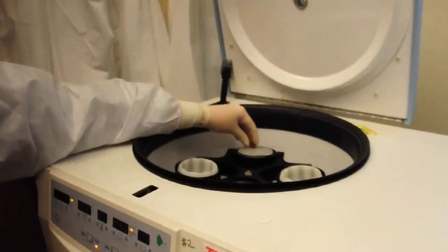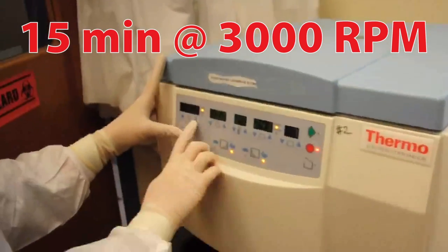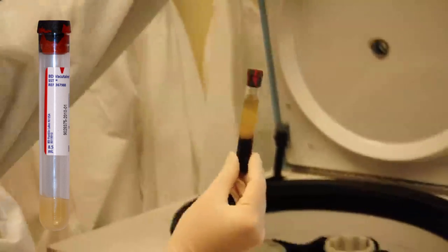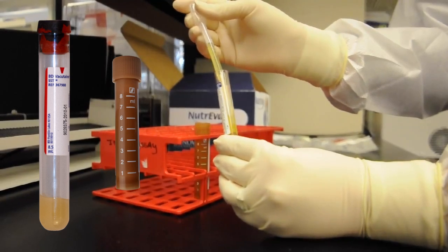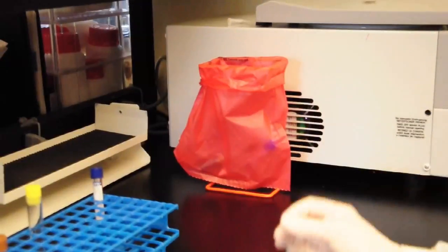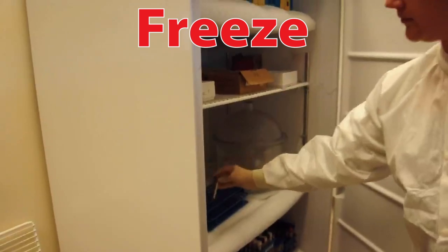Centrifuge the red Tiger Top SST for 15 minutes at 3000 RPMs. Once the red top SST tube is finished centrifuging, use a fresh pipette to transfer all of the serum into the amber transfer tube. Discard the red Tiger Top tube. Freeze the amber transfer tube completely prior to shipping.